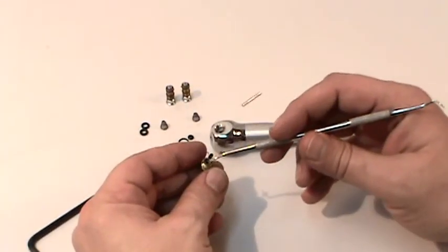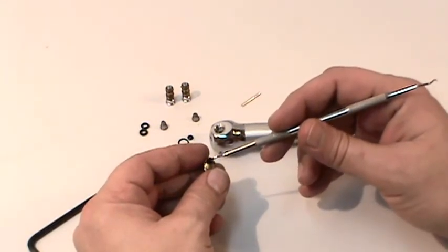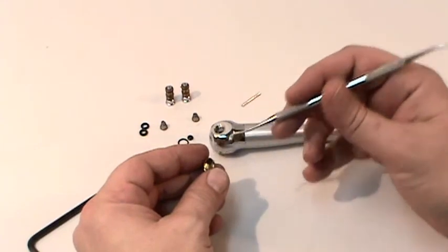On the quick tip release syringe, the O-rings will be replaced on the brass adapter nut, and then the adapter nut will be screwed back into the head of the syringe.